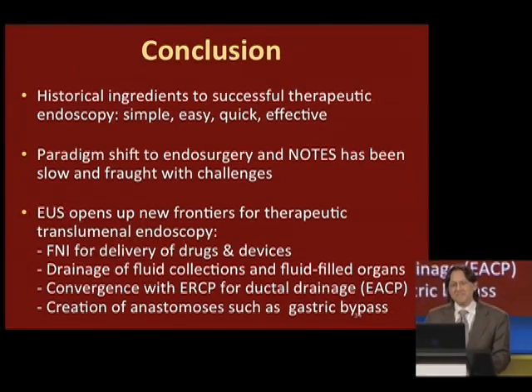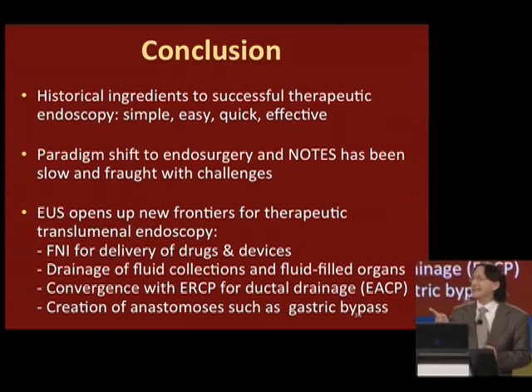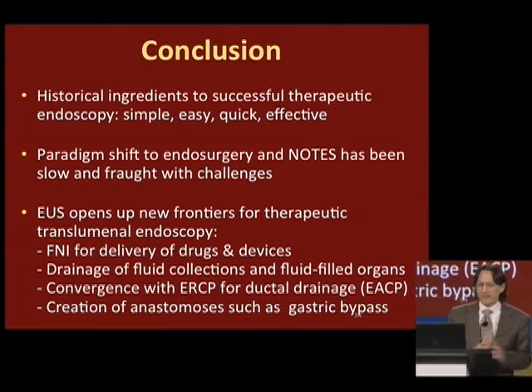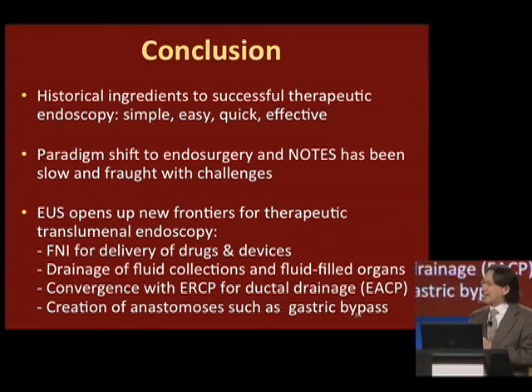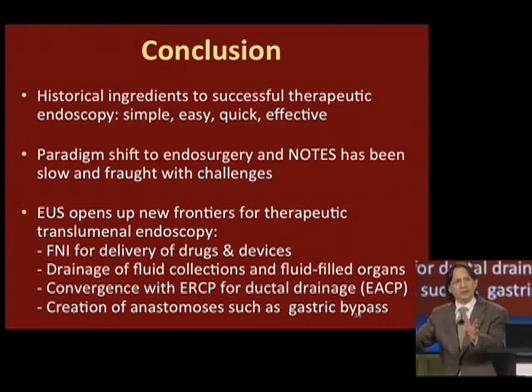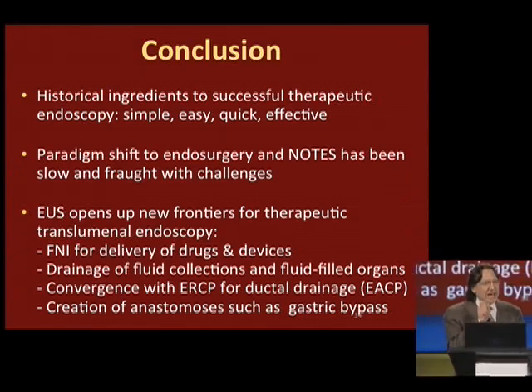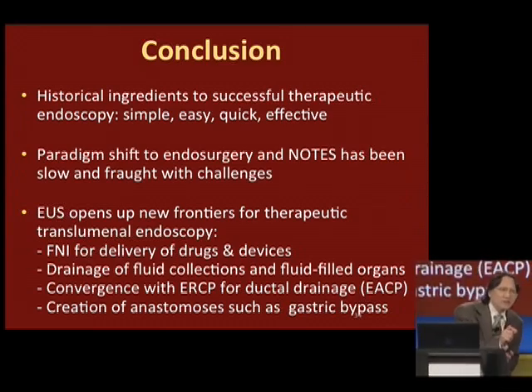So in conclusion, let's remember the historical ingredients to successful therapeutic endoscopy. Remember, simple, easy, quick, and of course, effective. There has been a paradigm shift to endosurgery, as well as NOTES, and NOTES is here to stay. The surgeons will continue to develop NOTES, there's no question. But that shift has been slow and has been fraught with many challenges, especially for the gastrointestinal endoscopists.